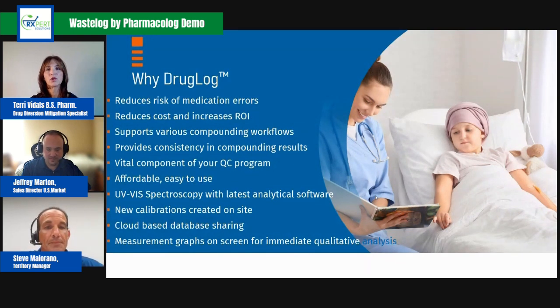Okay. So what would be the, I could think of maybe one, but what would be the reason that you couldn't just use the Wastelog to check your quality control? Why would you need both?